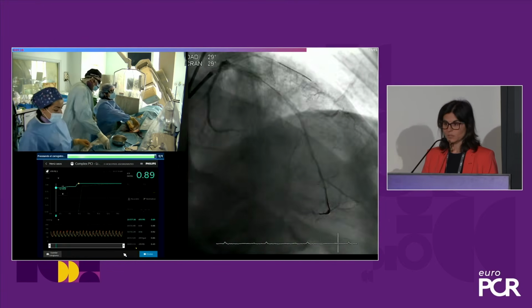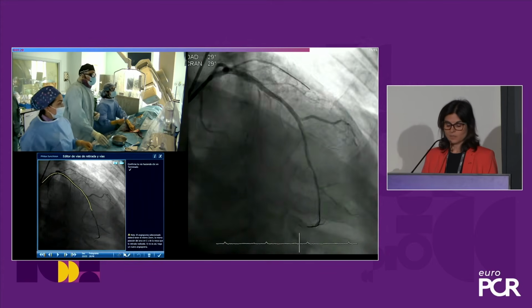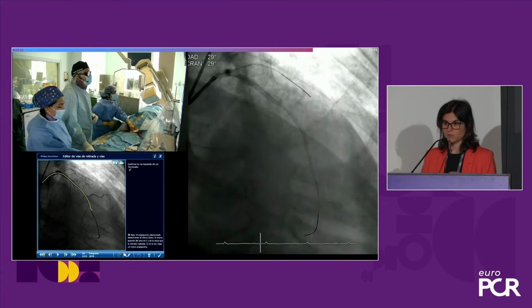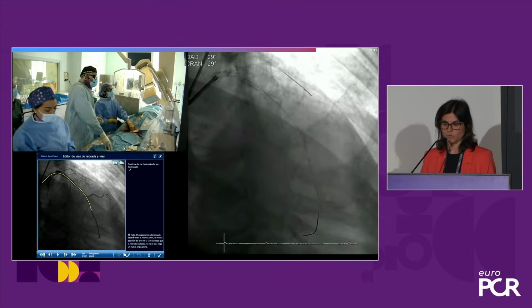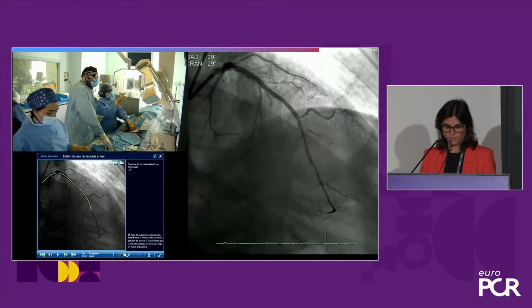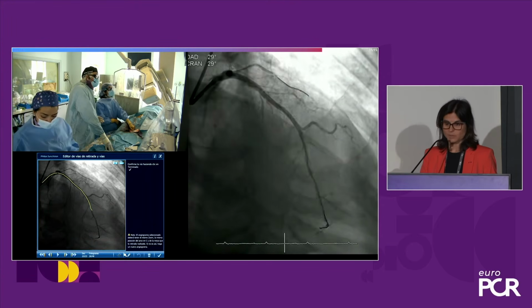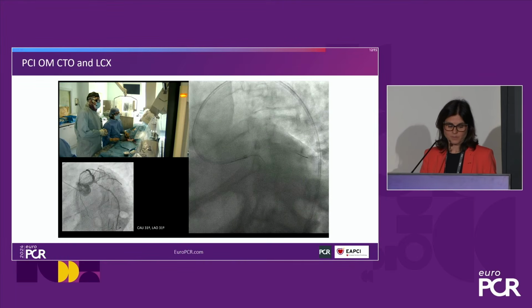The purpose of this injection basically is to understand if you have any perforation. And for example, in this case, it was also important to check the patency of this septal branch, a very big septal branch that is providing collaterals to the occluded right coronary artery. So this was the end of the procedure for the LAD: one injection of diluted contrast, 3 cc's.